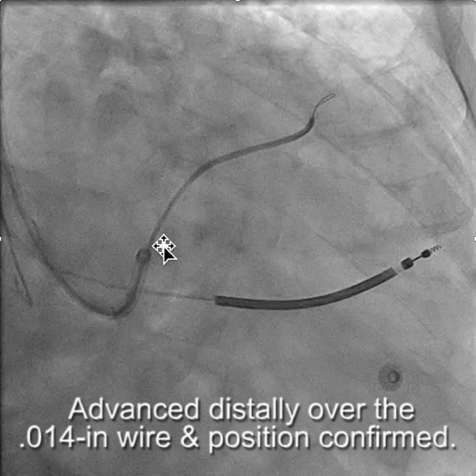The concept here is that you can direct the wire rather than just poking it around and hoping it goes where you want. With some practice and care, you can drive the soft vein selectors around inside the veins to get the wire exactly where you want it to go.